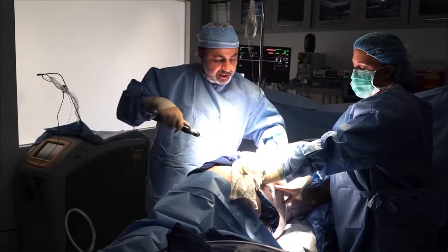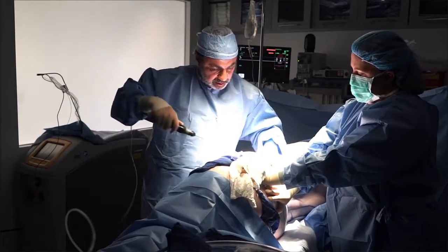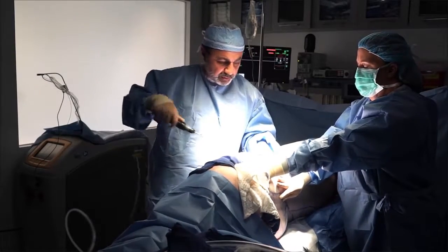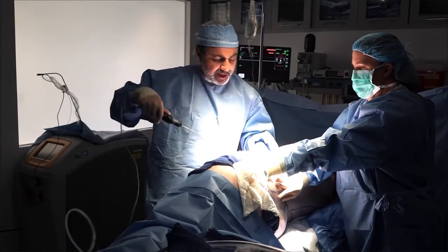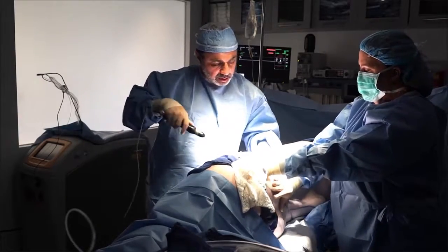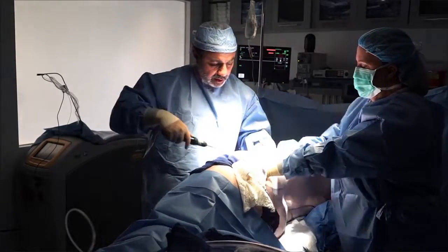Okay, so I can feel now that the Vaser has released a lot of those fibrous bands. So Morgan has what I would call distensible skin. She's lost weight, but her skin also has a very pliable quality to it. Morgan, let me ask you a question. Are your joints kind of more flexible? Yeah, they are actually, but I also do have quite a bit of joint pain.